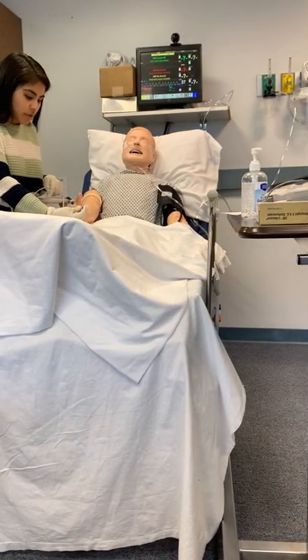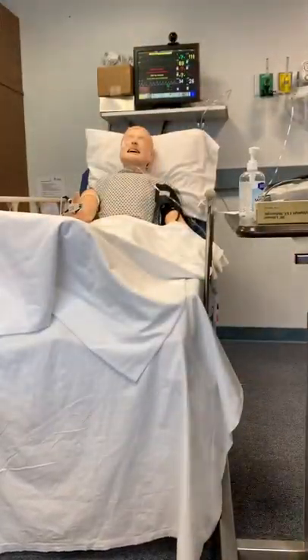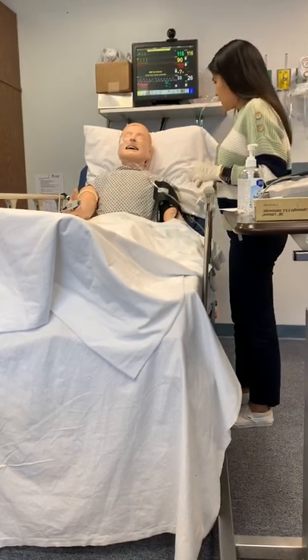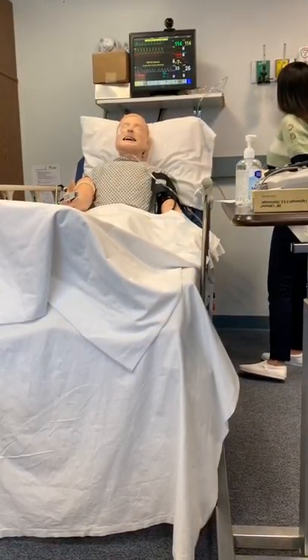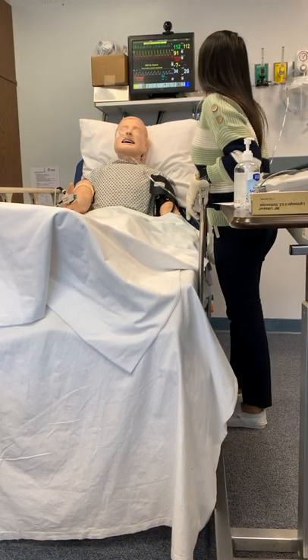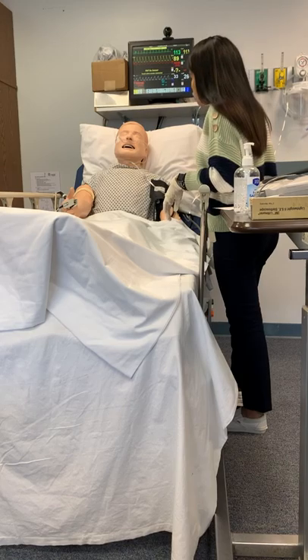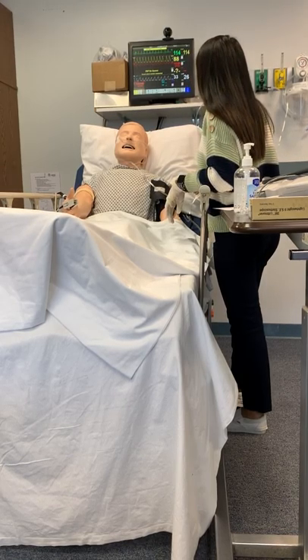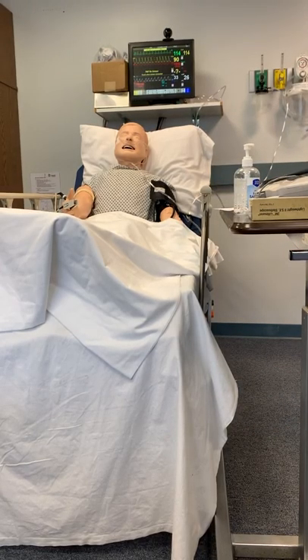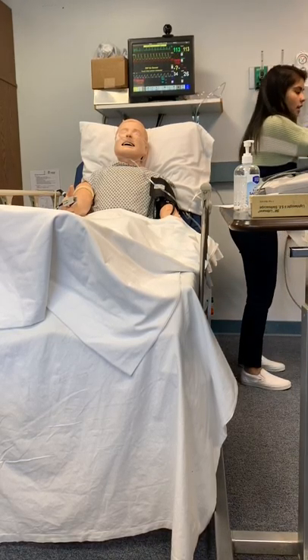Place this right on your finger, okay? You're going to take your blood pressure. So, it looks like you are on five liters. Your saturations are low — they're getting lower. I think we might have to switch you out to a higher device to give you what you need, because that's way too low for my liking. And you look to be in a bit of distress, so we're trying to get that fixed.